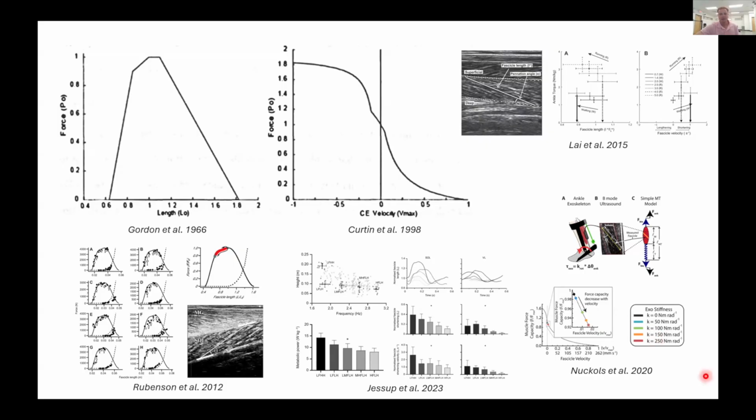But the main thing really to take away from this whole slide for the purposes of this presentation is that ultrasound was used in each of these studies to measure muscle dynamics non-invasively in humans to enhance our mechanistic interpretation.